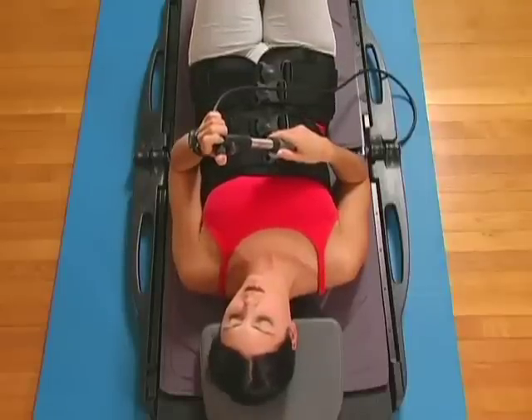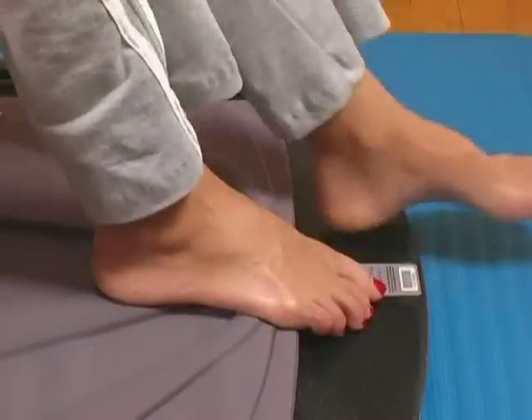If traction does not release, place your feet off the cushion and push down on your heels if necessary.